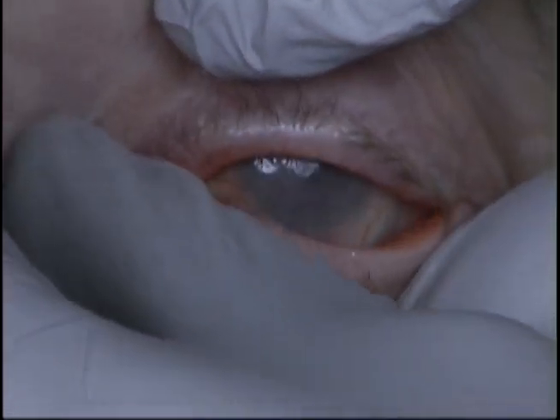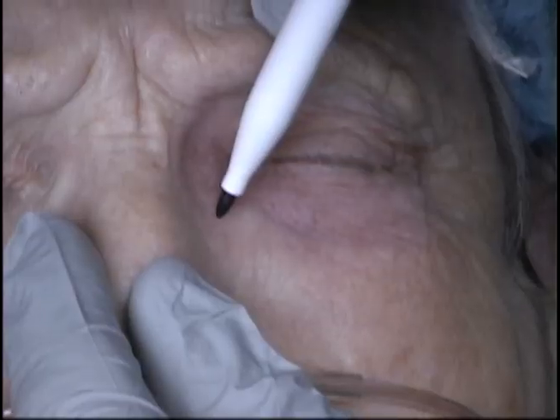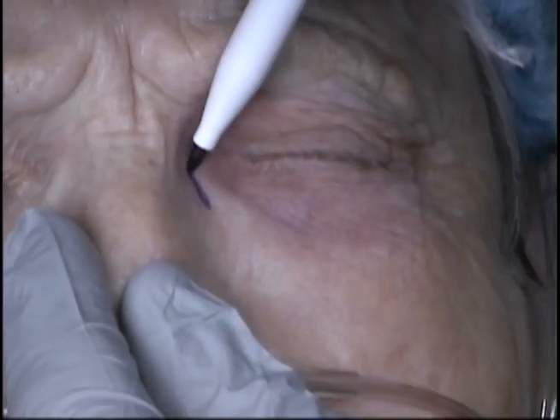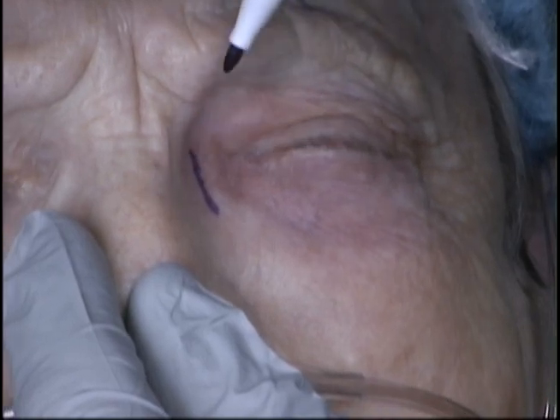Palpation of the lacrimal sac results in reflux of purulent material from the upper and lower puncta. A marking for the incision is then made along the side of the nose, extending from the medial canthal tendon inferiorly towards the ala of the nose.